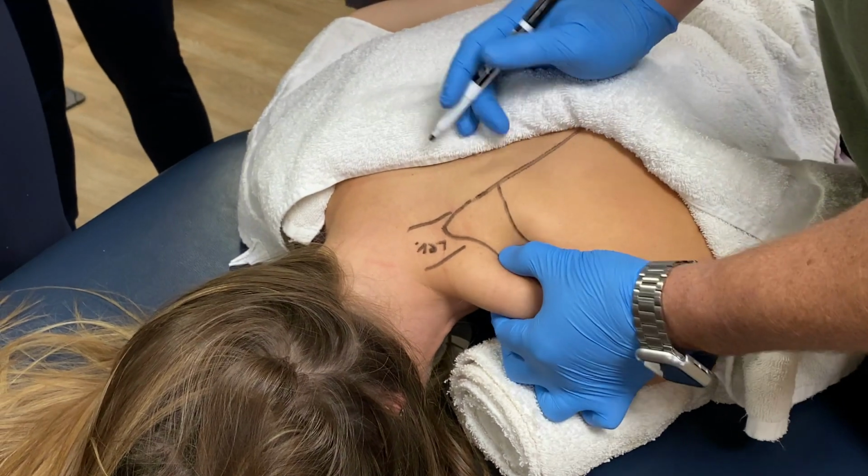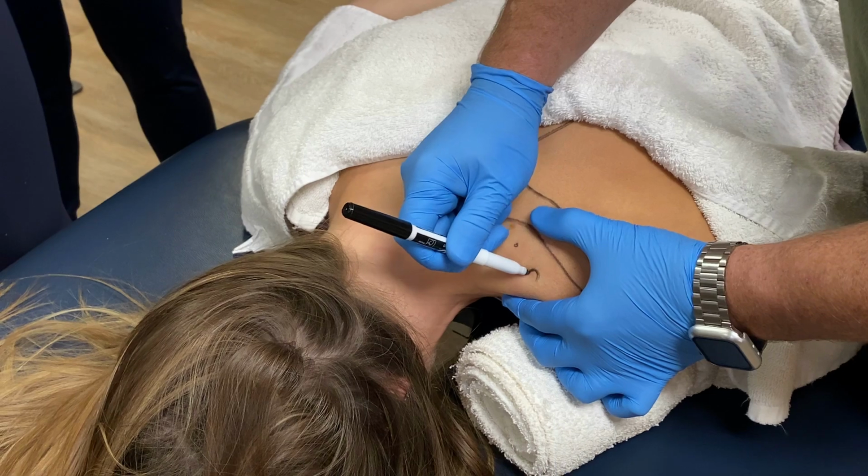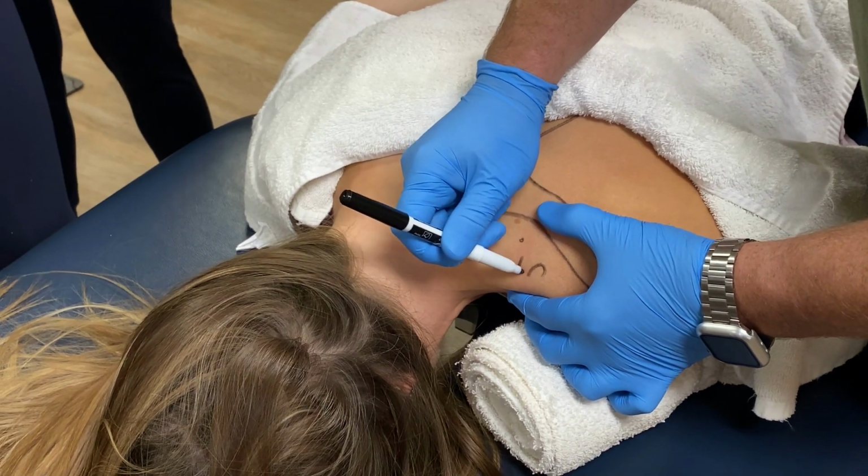And then upper trap, we're just going to pinch it. We'll get it right there. So it's going to be upper trap.